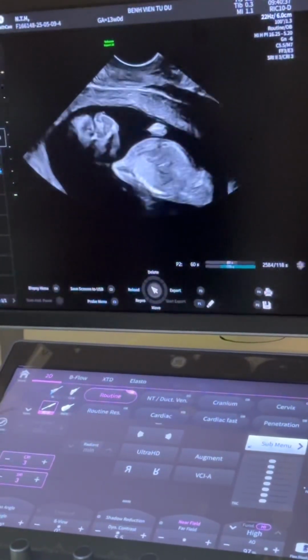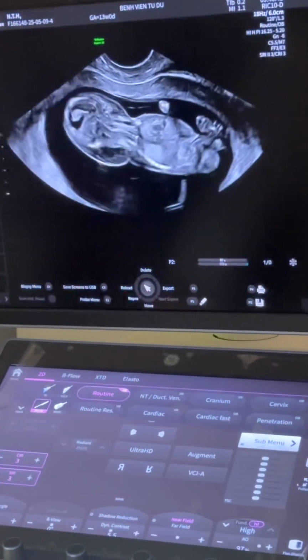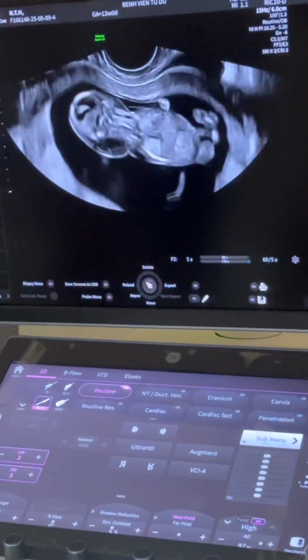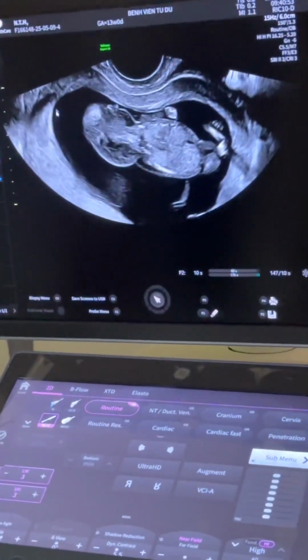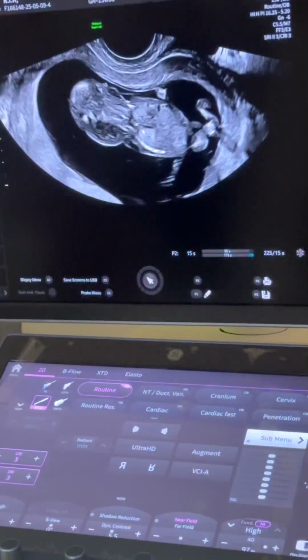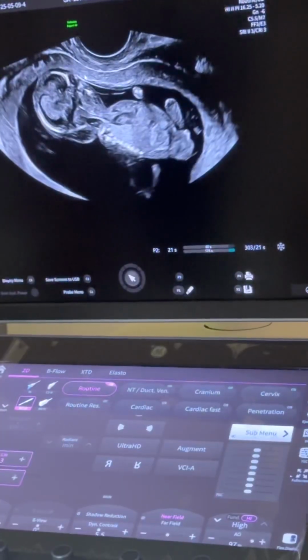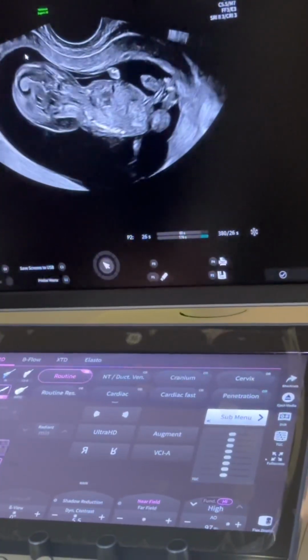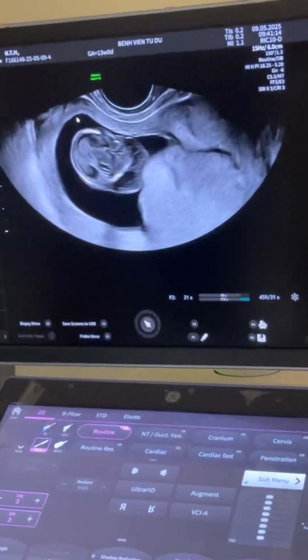If you're scanning a baby and it's in a coronal position in terms of doing a 3D volume acquisition, because sometimes it may not get into a nice position for doing a 3D volume acquisition later, then just pull back on your probe. Don't push your probe up too hard, because when you're doing a 3D, you always want to make sure that you have fluid all the way around the baby. Sometimes we end up pressing too hard, pushing the baby up against the uterus, but if you pull back on the probe, even very gently, I've got the face up against it, so I'm not going to do a 3D. Anytime I want to get a complete volume data set, I make sure that I've got fluid all the way around the baby, and the most important maneuver is to pull back on the probe.